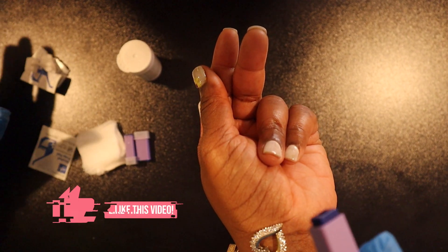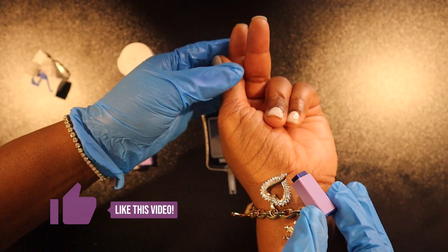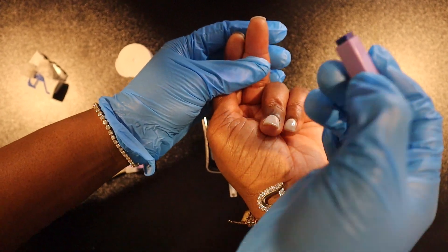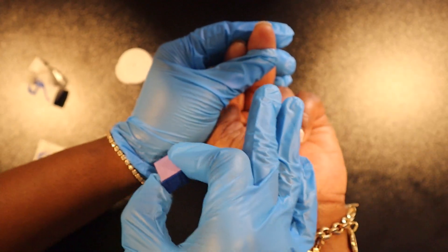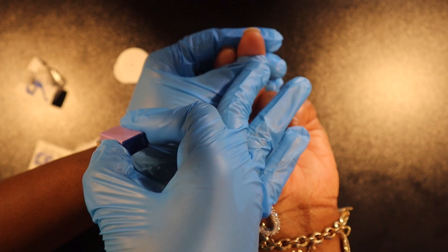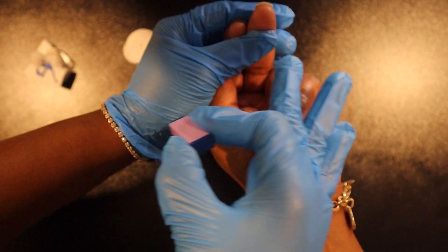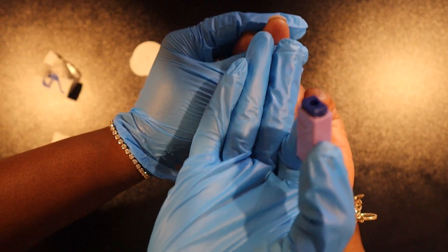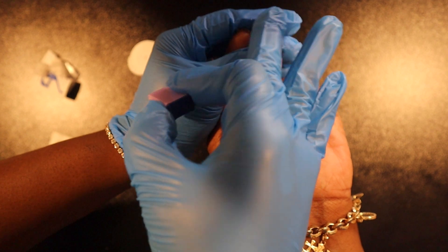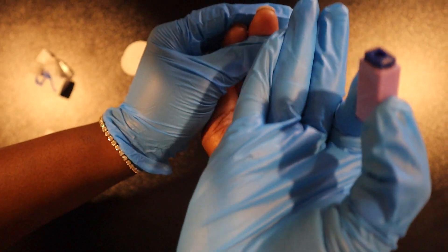A quick side note: we want to increase blood flow to the finger, and how you do this really depends on the facility or state you practice in. Some organizations will teach you to warm the finger using a warm cloth, some may teach the nurse to massage the finger, and in some states massaging is actually discouraged.